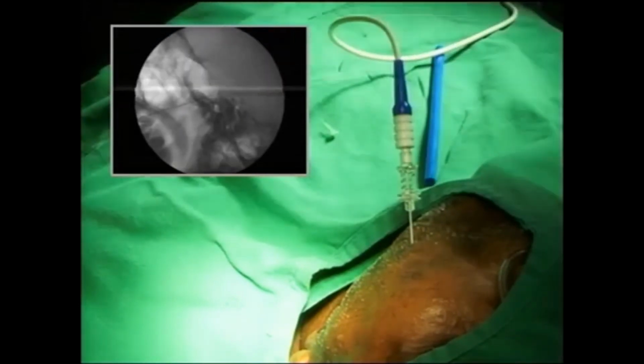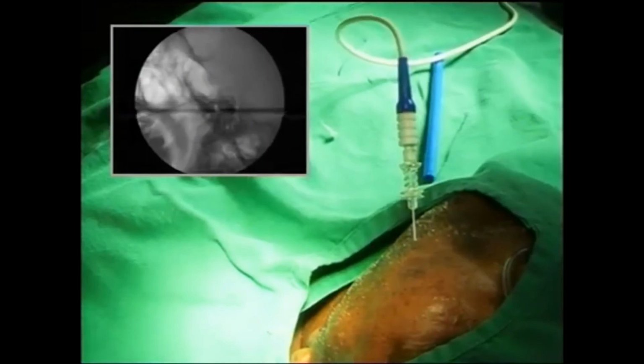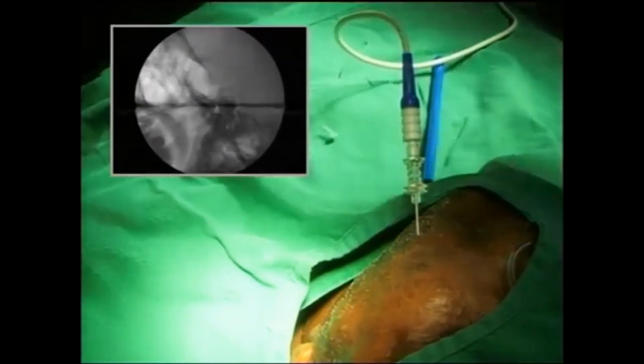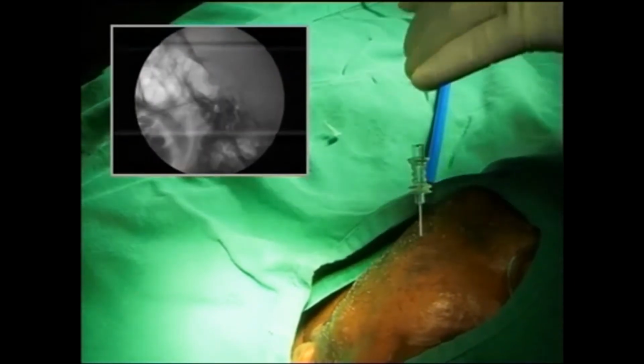Okay, so he is saying he is having some stimulation where he had pain, and also I have ruled out masseter contraction. So I'm happy with that. So I'm going to do the RF ablation. Before that, I'm going to inject a little bit of local anesthetic there.